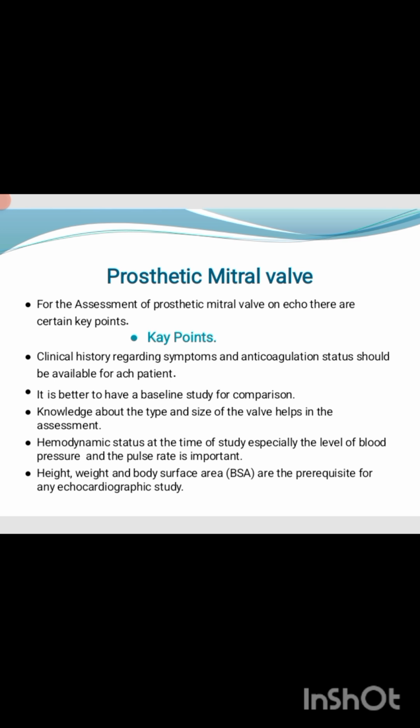How do we assess the prosthetic mitral valve and what should the Doppler parameters be? For prosthetic assessment by echo, there are certain key points.